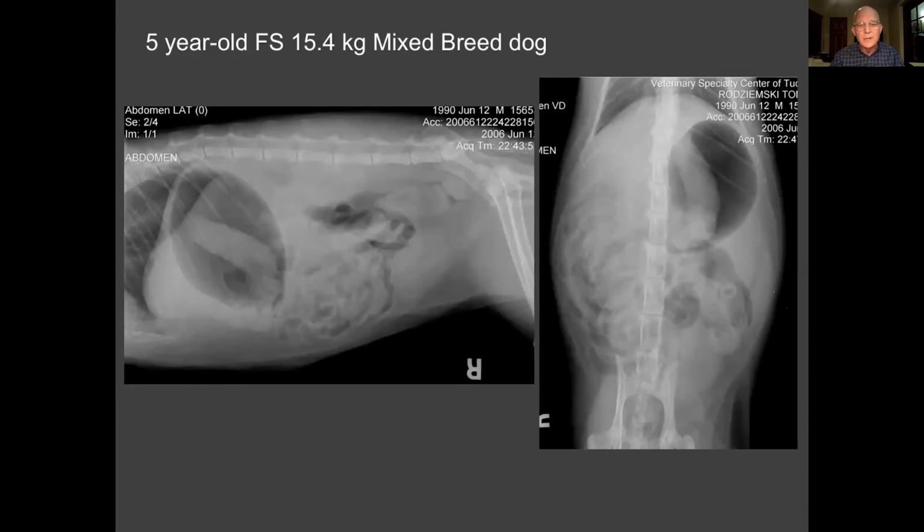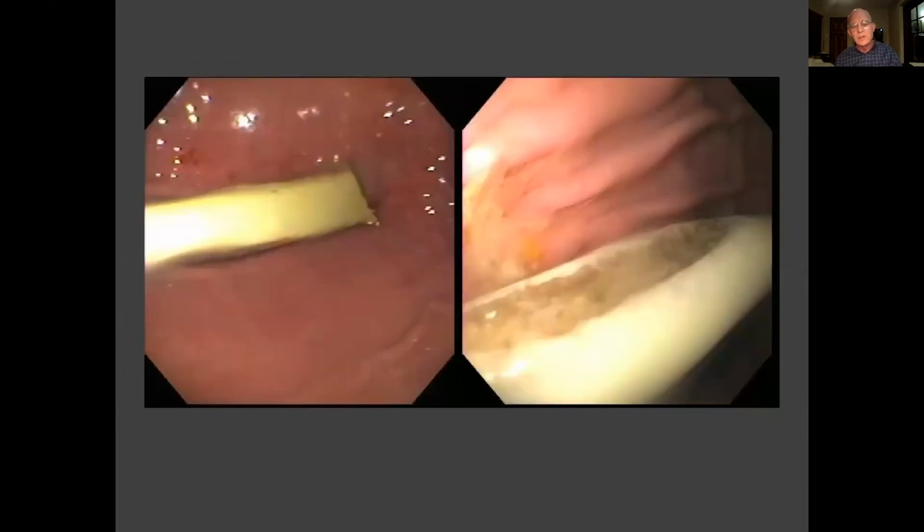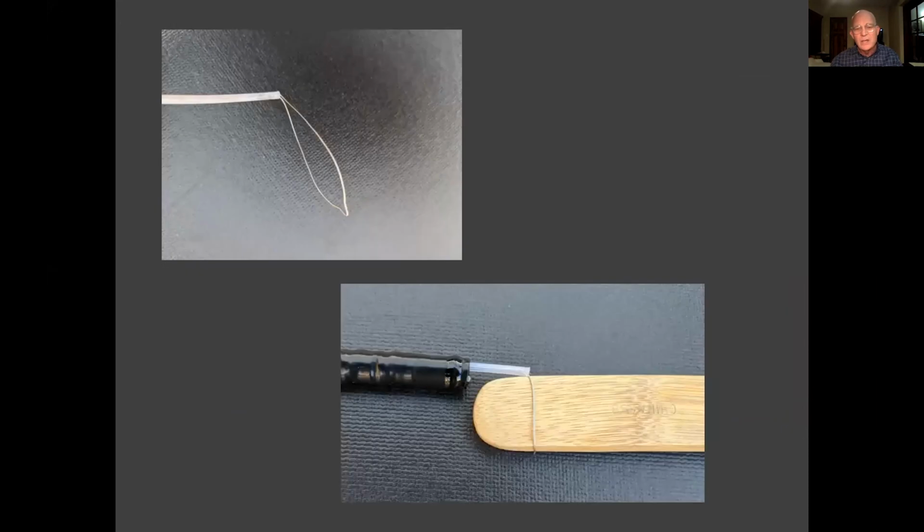So when I went down there, again, this is a pretty long bone in this area, and to orient this in such a way to get it through the lower esophageal sphincter was difficult. But interestingly enough, we got one of our used polyp snares, and I don't know if you've ever used one, but when you push the wire out, it almost comes out at a 90-degree angle. So I thought, well, maybe that would work. Here's just an example of what I'm saying. So I got the snare and it came out sort of at a 90-degree angle.